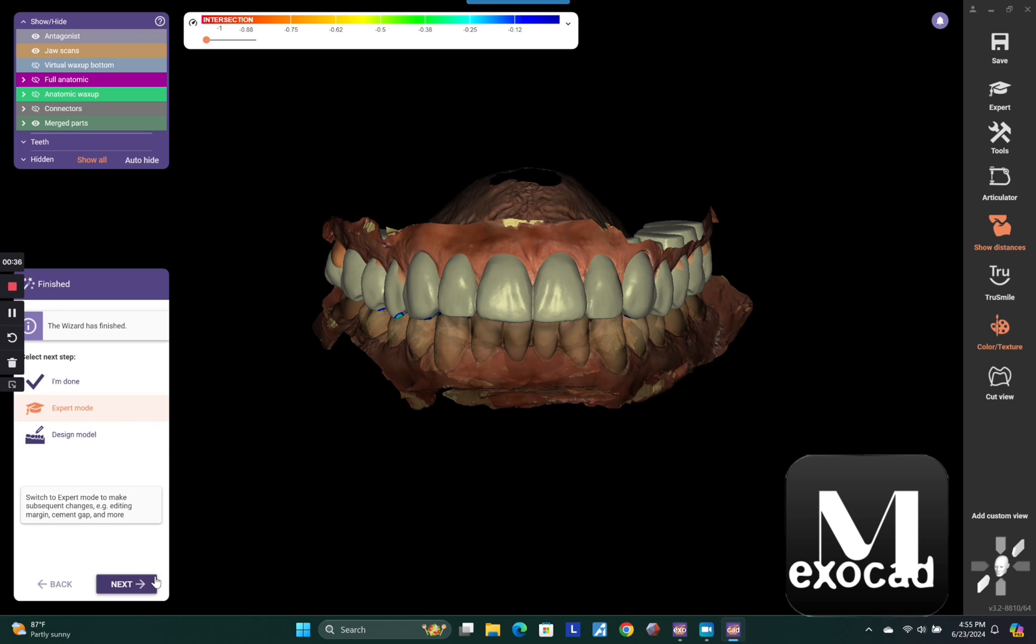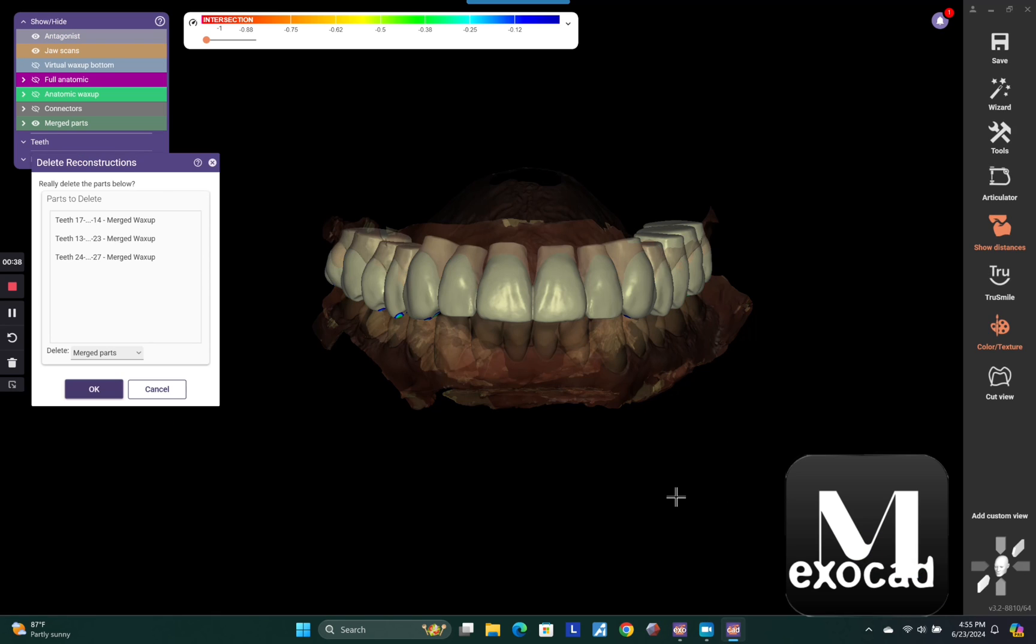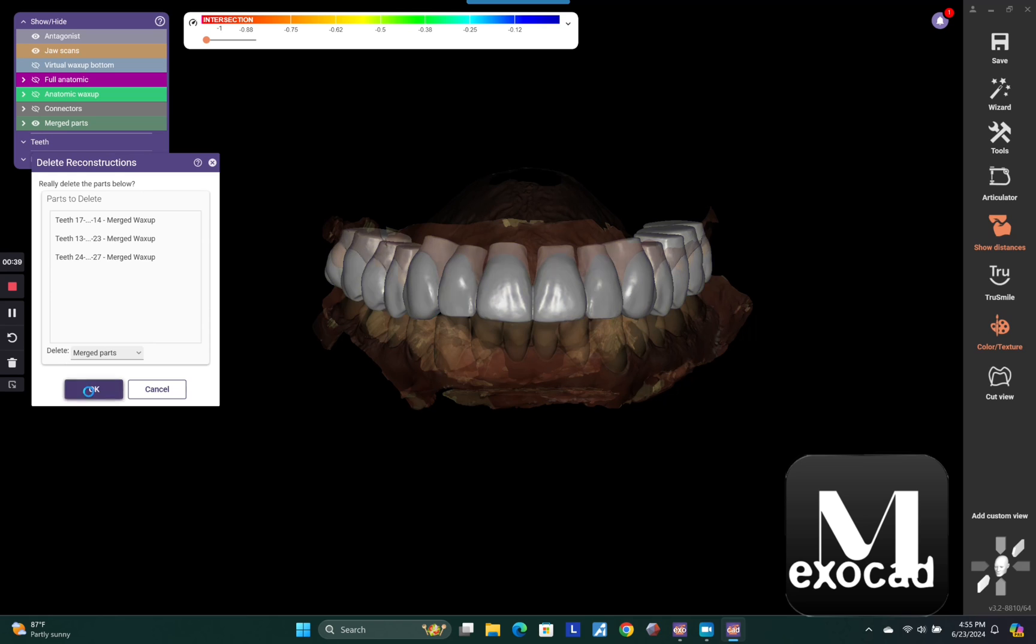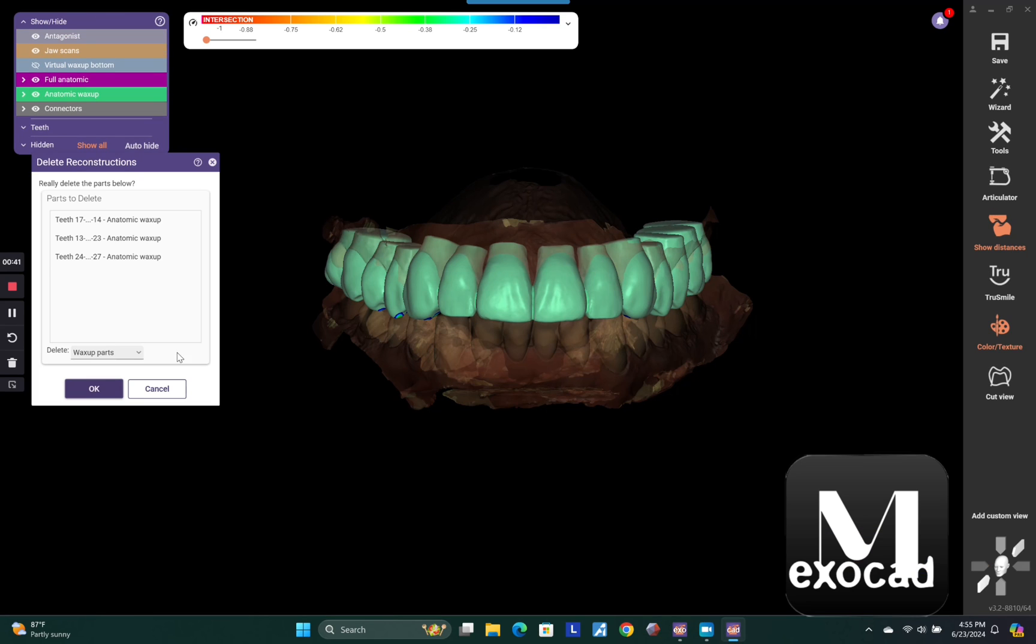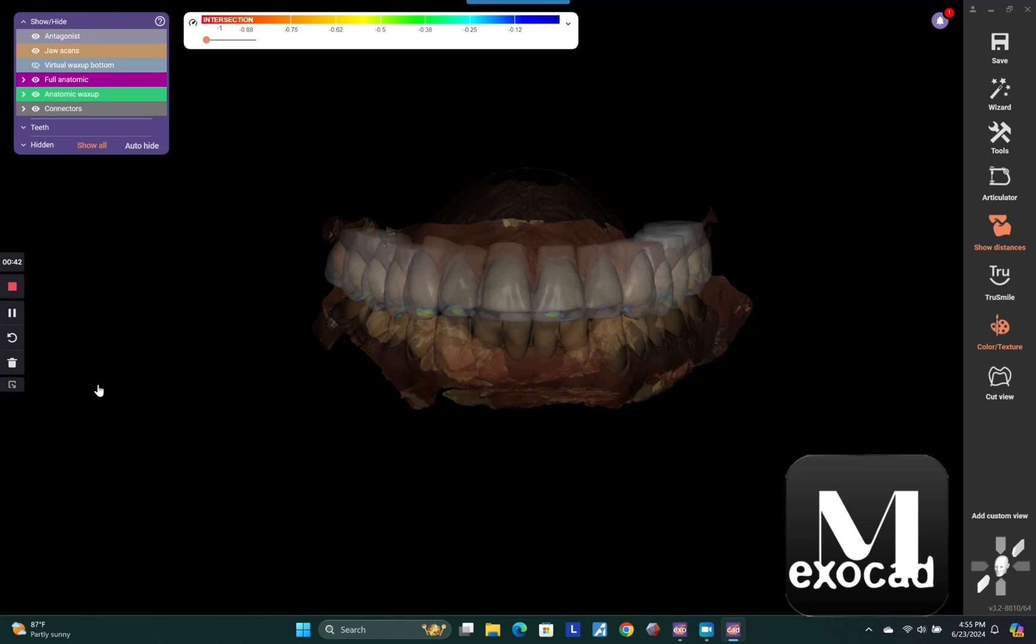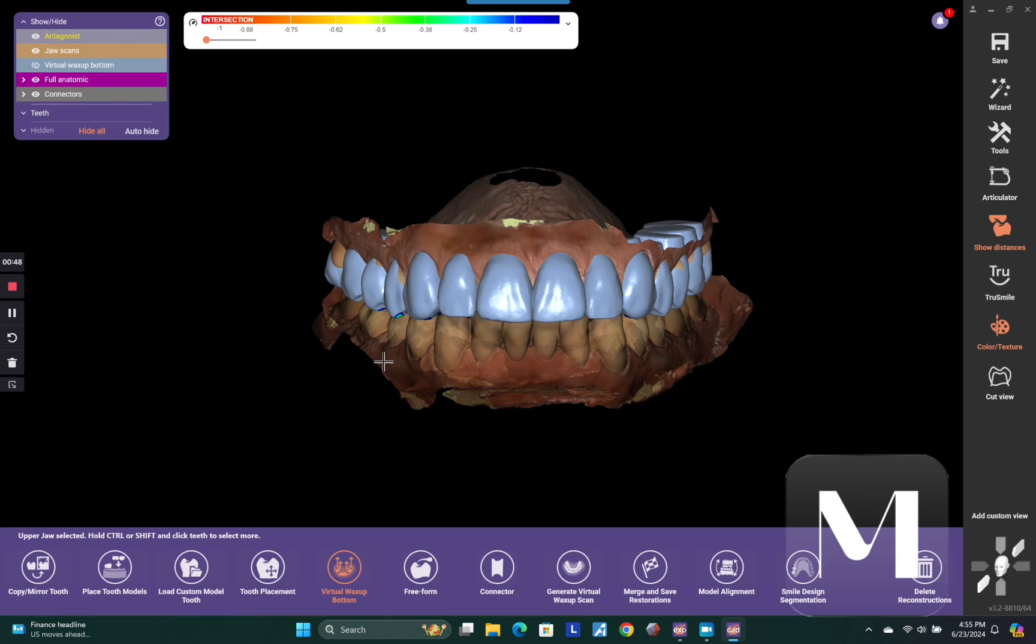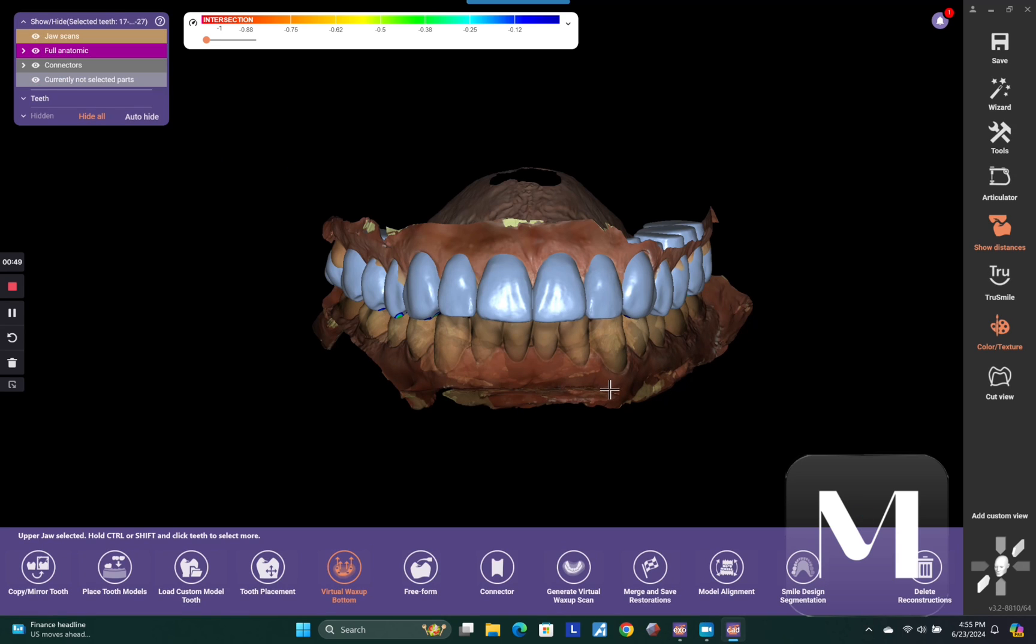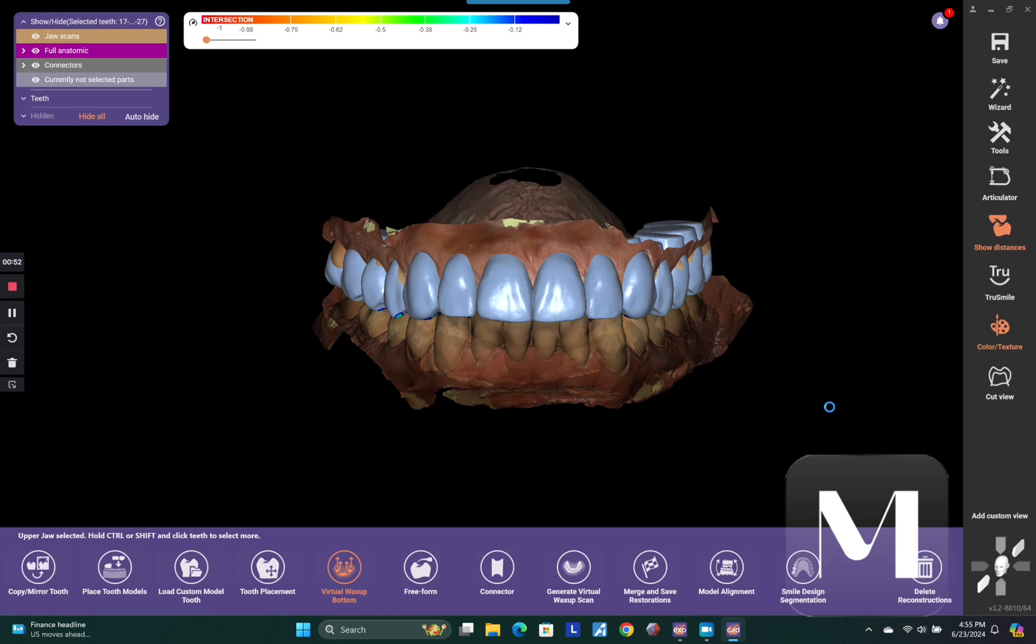So first thing you need to do is go to expert mode and hit next and then go to delete reconstructions. You're going to delete the merged part, then you're going to delete the virtual wax up bottom and then one more file. You need to come down here and find the virtual wax up bottom and delete that.